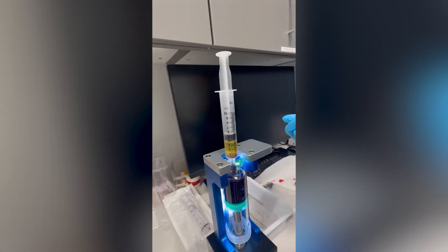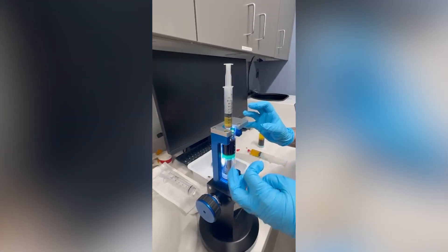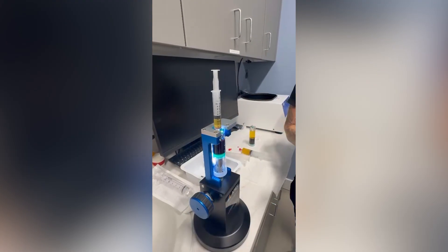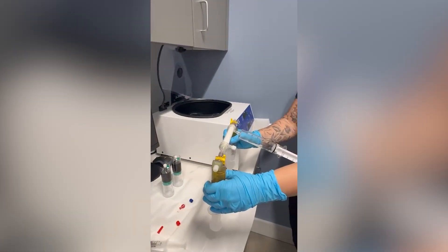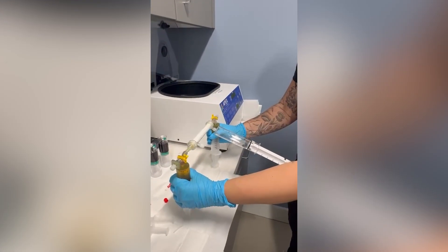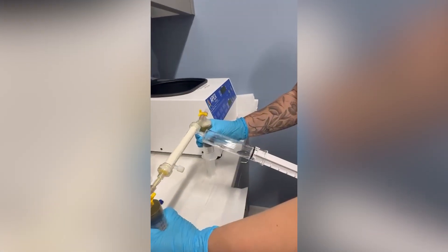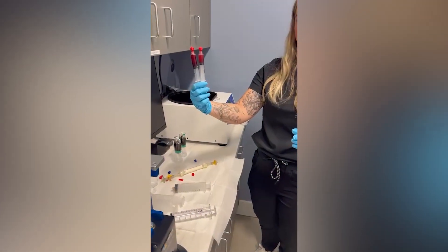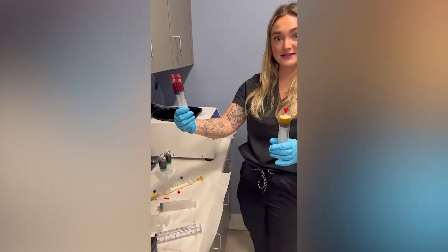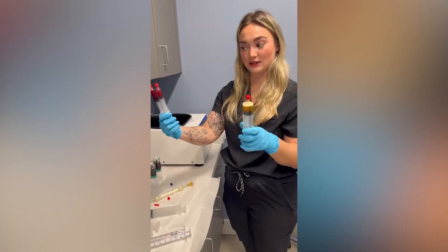That is still considered a leukocyte-poor PRP. If you wanted a leukocyte-rich PRP, we would stop here and then continue to go 1 ml into the red blood cell. I call this milking the cow — basically I'm going to pump back and forth, and all that water falling into the vac lock is the water from the plasma. This is your PRP. This holds all of your platelets, and that's going to help with tissue regeneration, healing, everything like that.